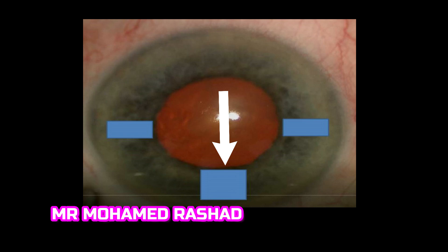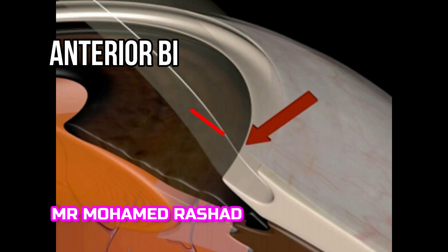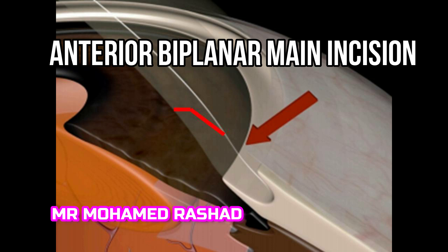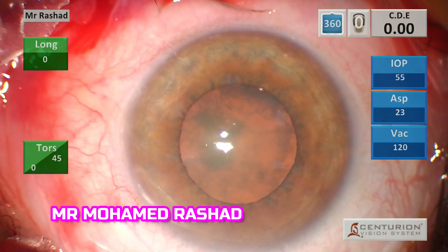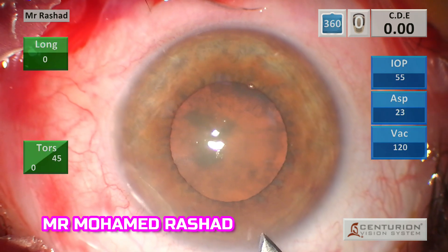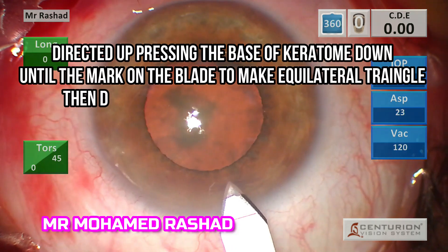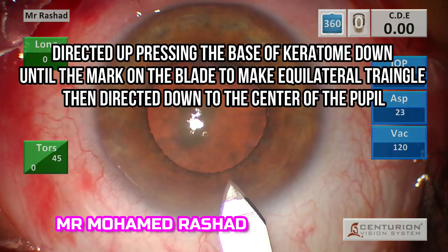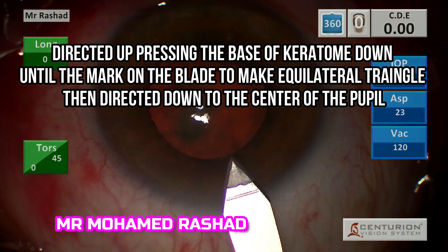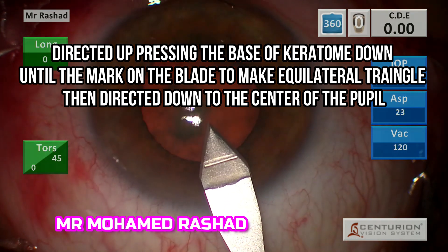The main incision has to be a long tunnel to avoid iris prolapse, extending to the pupillary border. We go first directed upward to be biplanar, then directed to the center of the pupil. In slow motion: go with the keratome base down and tip up, directed into the corneal stroma until the mark on the keratome, then change direction to the center of the pupil downward.